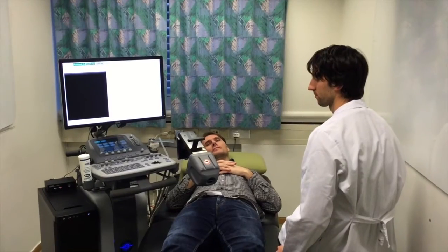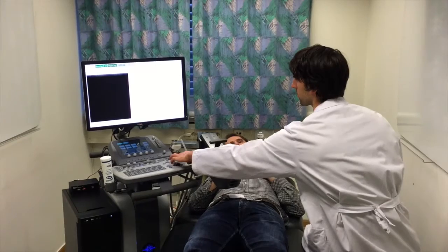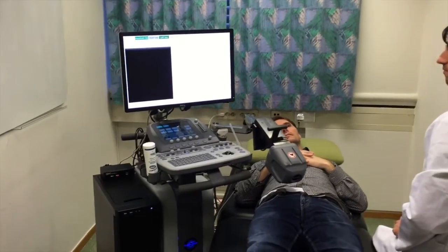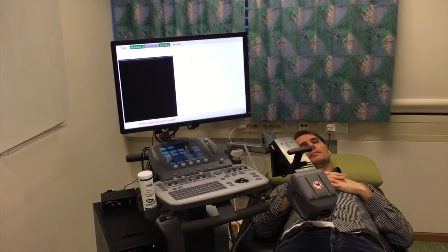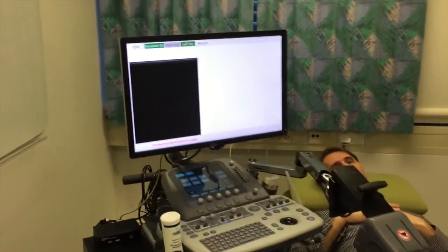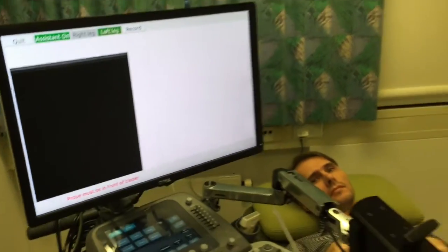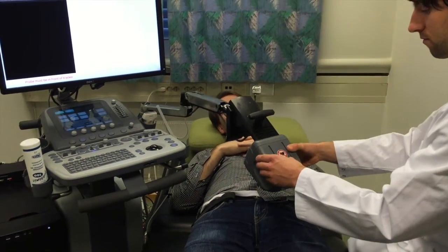For scanning the left leg of the patient, the setup looks like this. The operator sits on the right side, and it's important that the ultrasound machine is put closely to the table so that the electromagnetic tracking reaches the left leg. It's important, again, to have the left leg selected in the assistant. The electromagnetic tracking should be placed over the femoral region of the left leg.